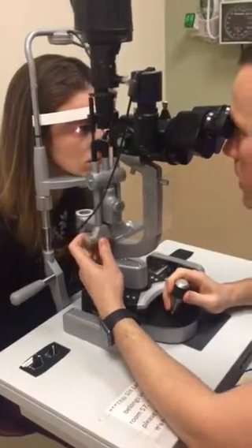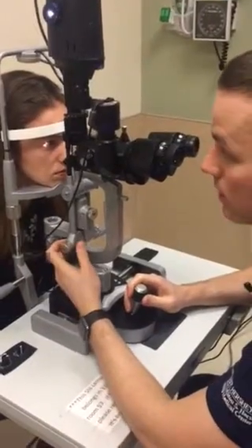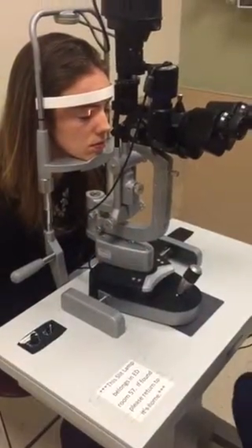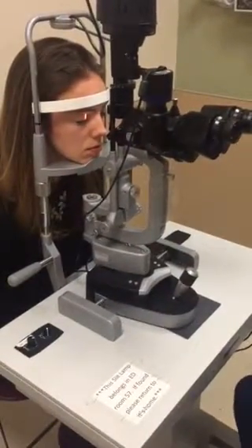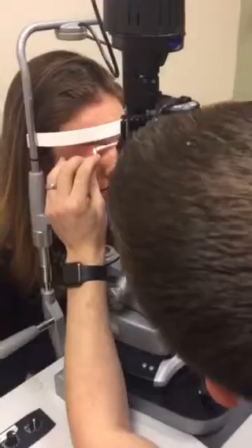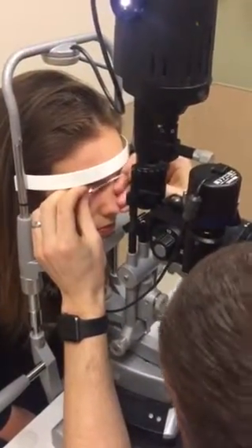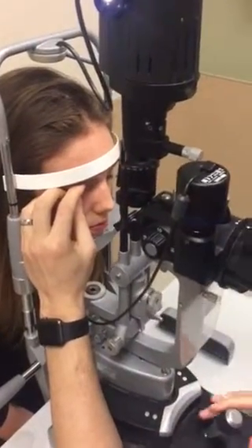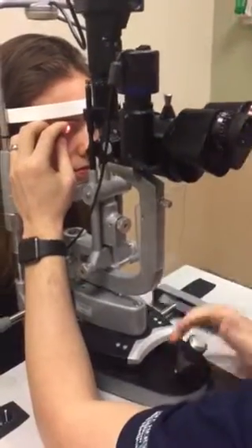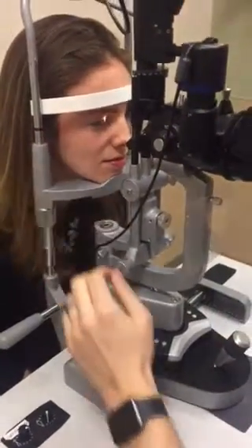At this point you can do an eyelid eversion if it's indicated. Obviously if somebody's complaining of a foreign body sensation, you should do an eyelid eversion. Could you close your eyes — don't squeeze them, just keep them gently closed. I'm going to turn your eyelid inside out. You can hold it there and then scan the eye. That looks pretty good. I'll turn that back. Open up your eye. So we've done lids and lashes.